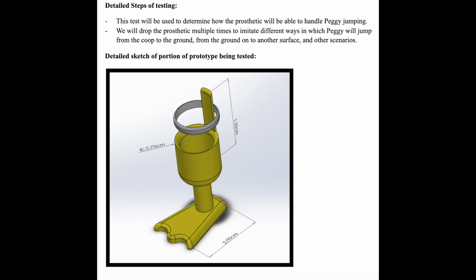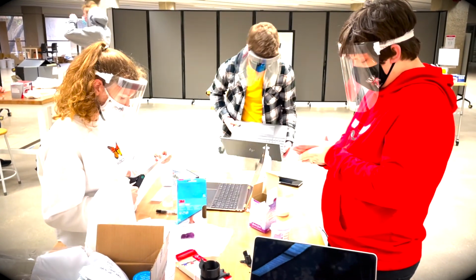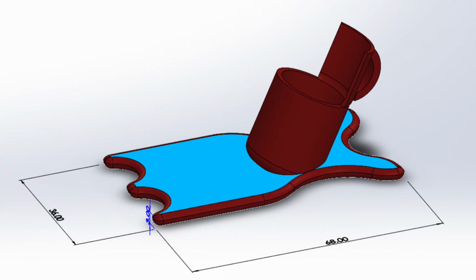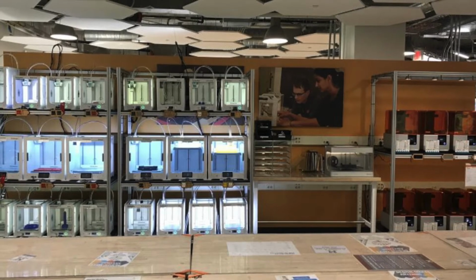After our product was completed, we then wanted to complete some tests on it to see whether or not the material is what we wanted to use. We did this through some drop testing, seen here, where we dropped it from various heights to see if the material would chip. We then also did flexibility testing to see how much the material would flex, whether it's upward, downward, side to side. Our team then made slight adjustments to our design, such as making it more angled for ease of use for Peg, as well as making the basin a little bit smaller so it doesn't move around as much. And we determined that the TPU filament was correct for what we wanted.